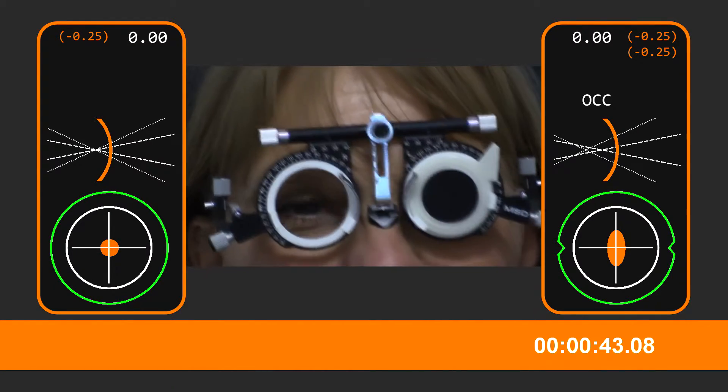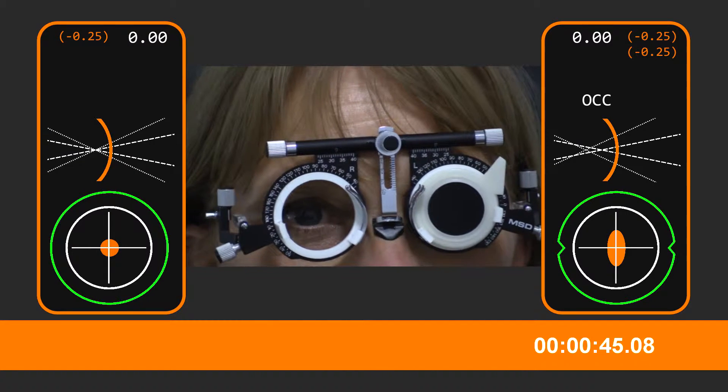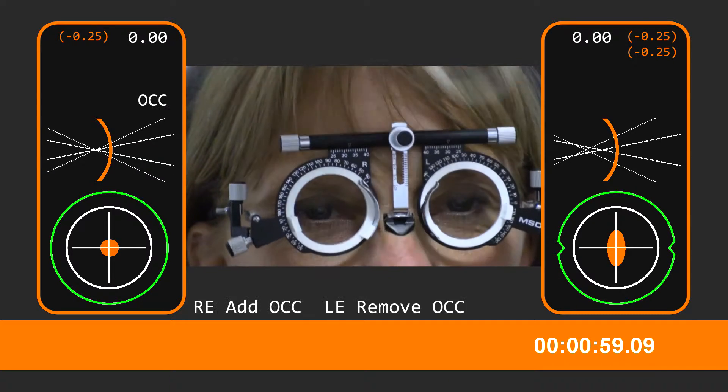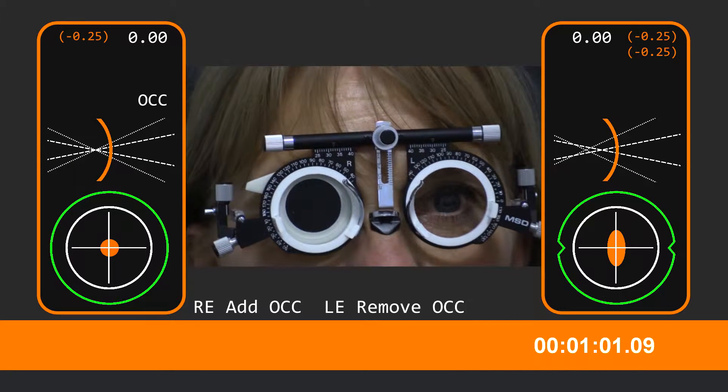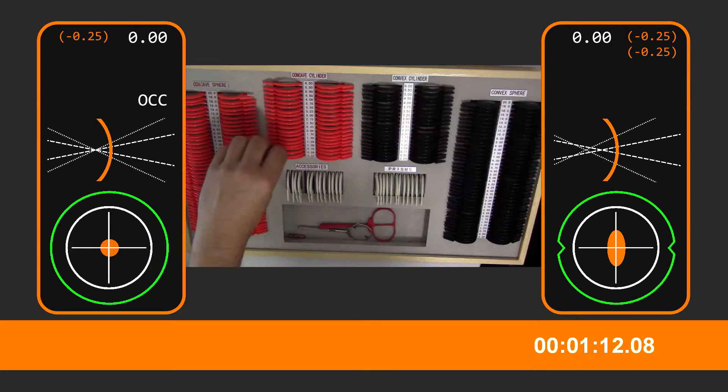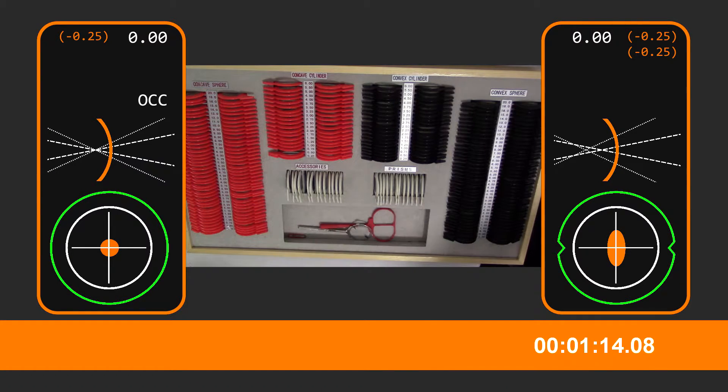So which one — what was the lowest line you can get? F, O, T. I see, I'm doing it again — A, L, T, O, F. I'm struggling with the bottom line, like an A. I can just about make it out, a bit of a struggle obviously. What about this one? R, Z, N, F, D, A, L, T, O, F. I can't read the bottom on that. Oh, that's going bad, isn't it.